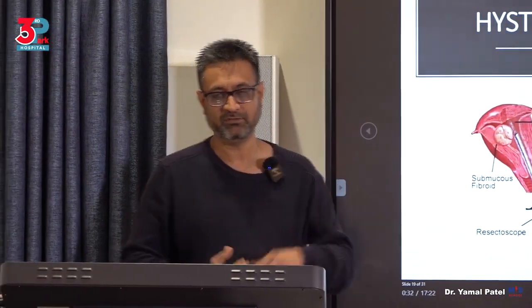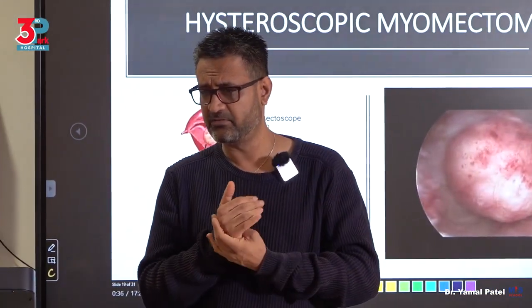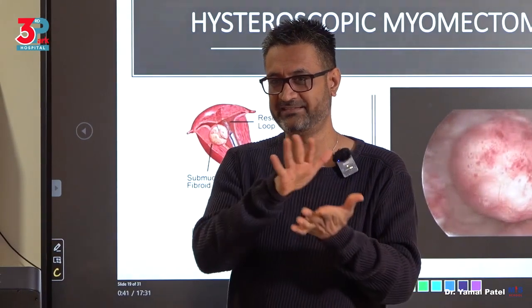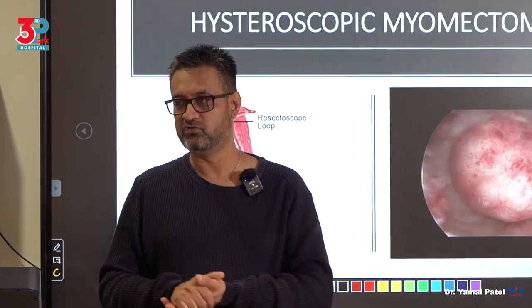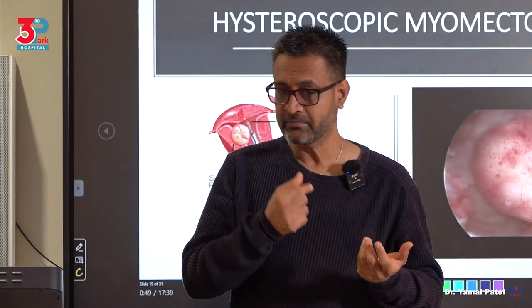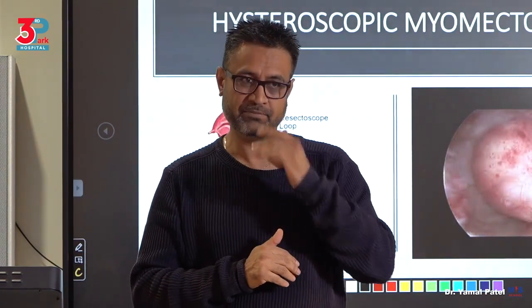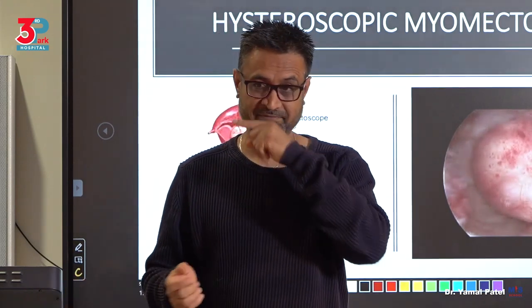And sometimes people have used it in Asherman syndrome, although I personally don't prefer energy in an Asherman's uterus. All right, so an Asherman's uterus is already damaged. You use energy, you may damage it a bit more. I mean, it will open the cavity up. There's no problem. It will be very good because there will be no bleeding. But you know the problem? The problem is Asherman syndrome already has damaged endometrium. You get what I'm saying?